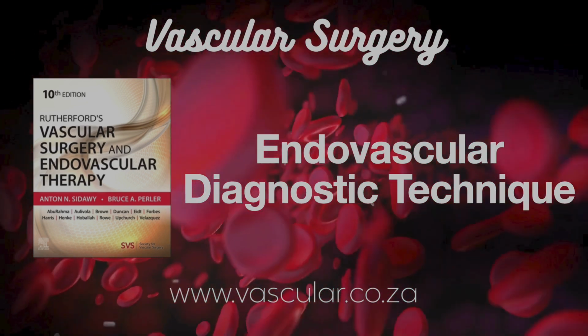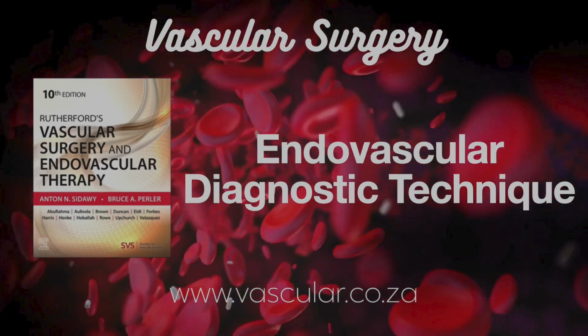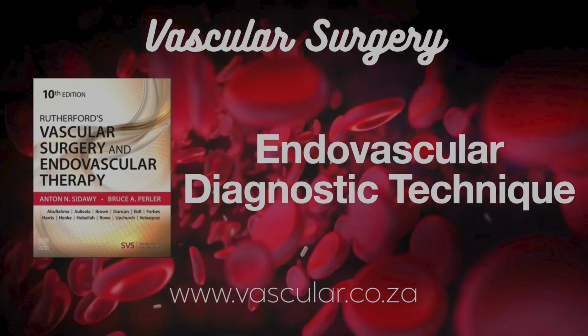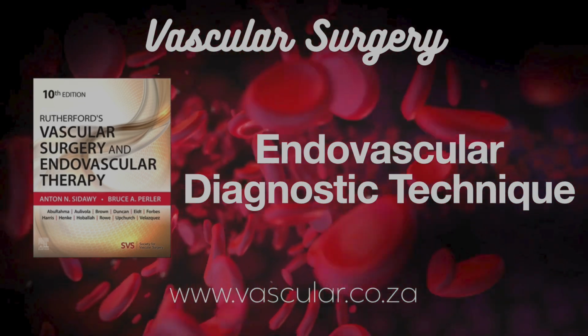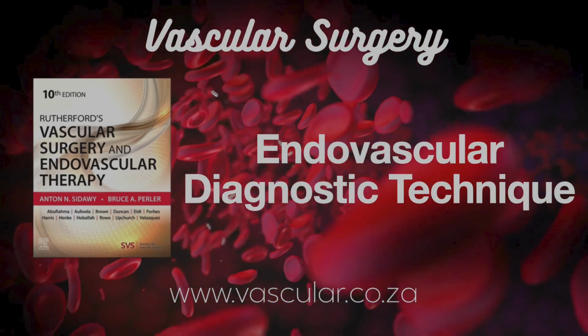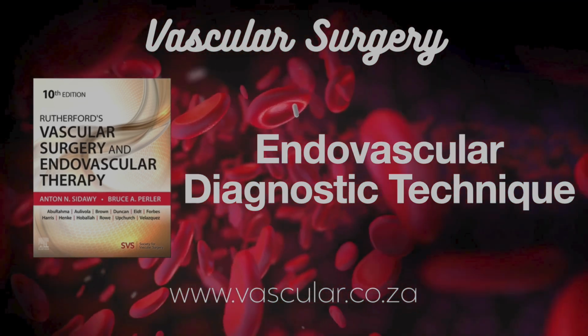Are there risks with these devices? There are potential risks, yes. A slightly increased risk of groin infection compared to manual compression, and rarely leg ischemia if the device misfires or causes a blockage, but they can significantly cut down hemostasis time. It's a balance. Okay, let's shift to specific applications.